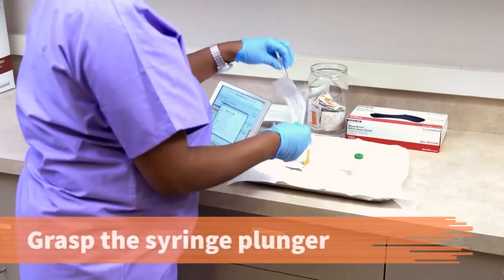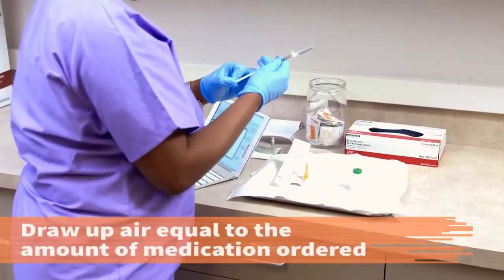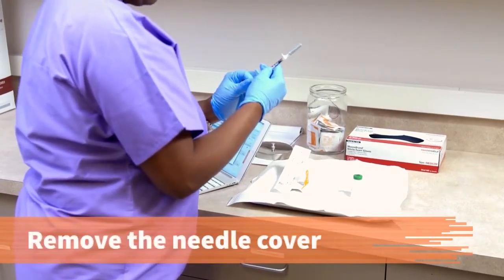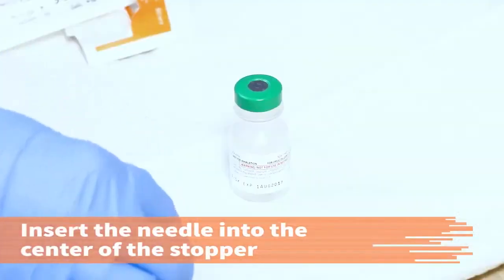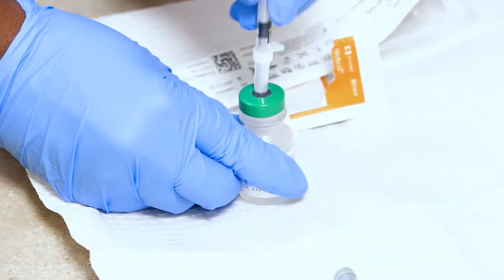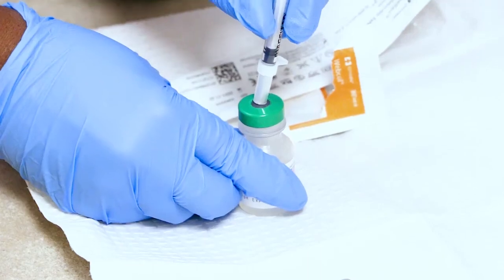With the needle cover in place, grasp the syringe plunger and draw up an amount of air equal to the amount of medication ordered. Remove the needle cover. Hold the vial firmly against a flat surface and insert the needle into the center of the rubber stopper. Careful that the needle touches only the cleaned rubber area. Inject the aspirated air in the syringe into the vial.